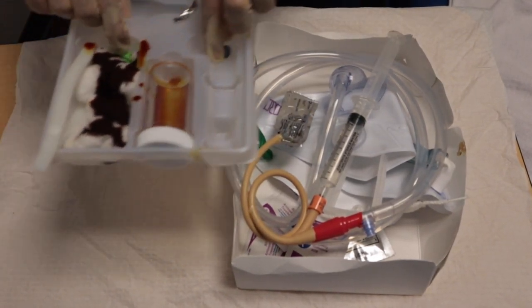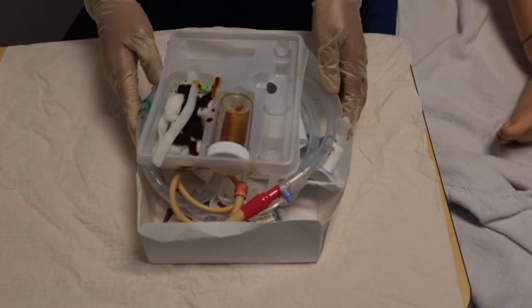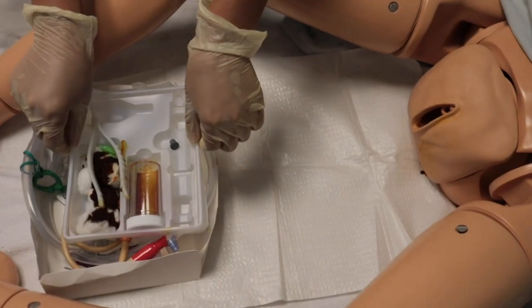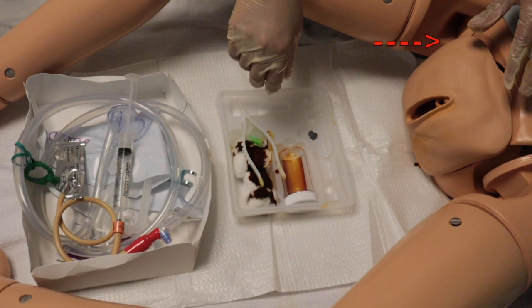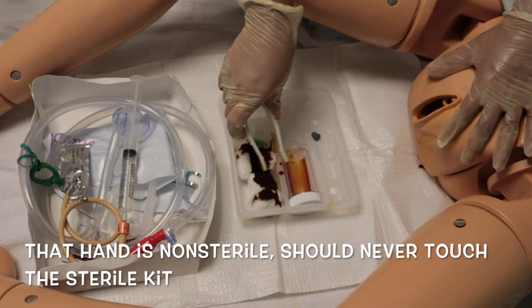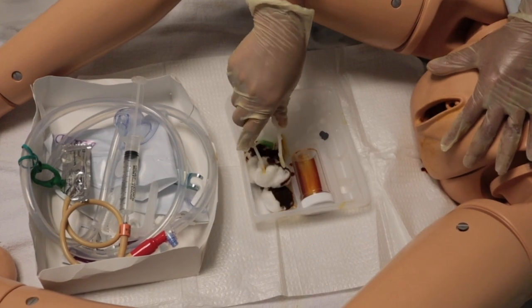Pick up the small tray and put it inside the large kit. Move the kit onto the square drapes. Move the smaller tray to the inside. With the hand closest to the patient, make a V around the patient's outer labia. That hand is now non-sterile and should never touch the kit. Grab the tongs and pick up the saturated cotton balls.